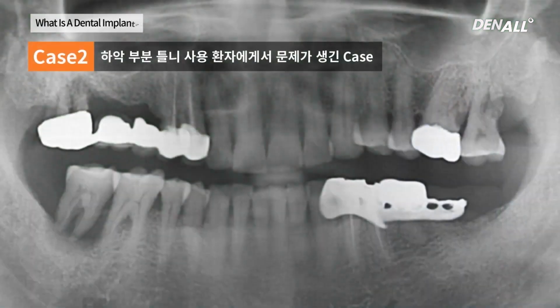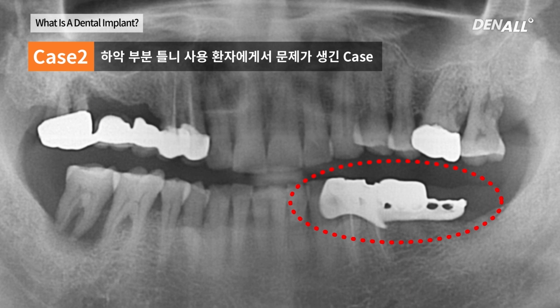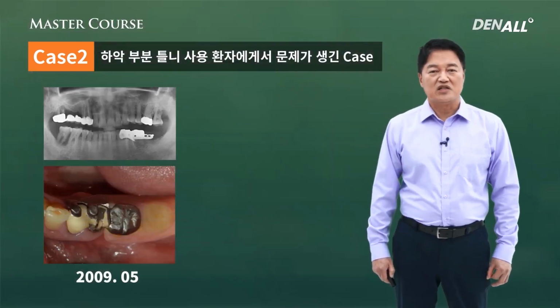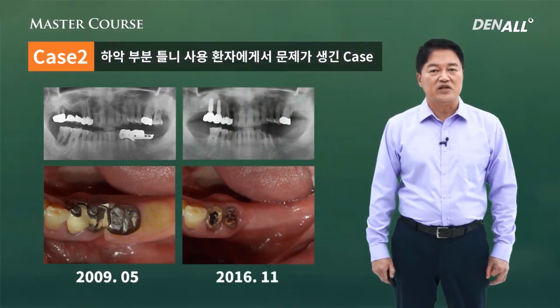Let's look at a second case. In the lower left quadrant, the two molars were missing, and on the two teeth in the front, the surveyed crown was used and partial denture was used. As the patient used this for a long period, a problem erupted in 2009.